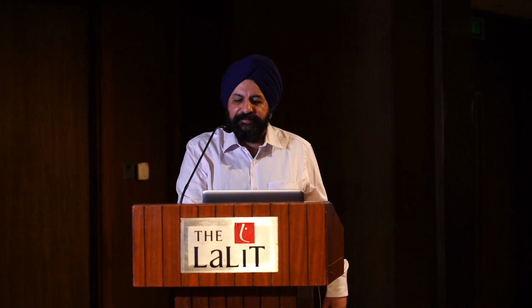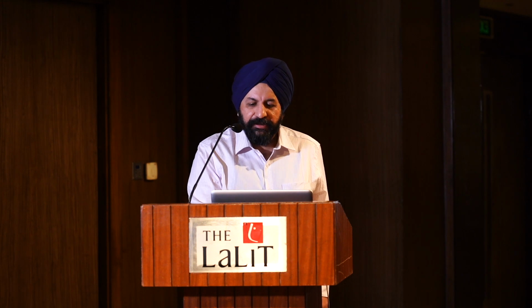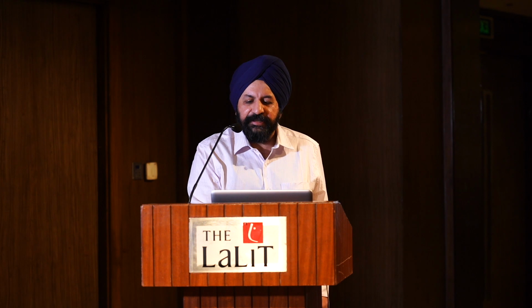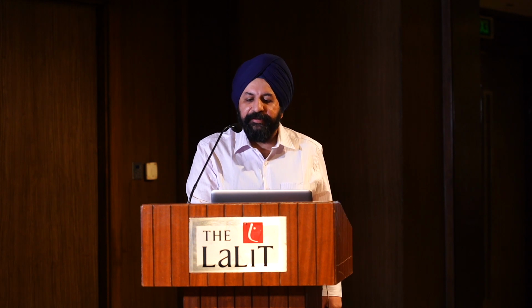Broadly, based on this, different analyzers have different technology. The one that I use is called Mindray BC6800 Plus, which uses the SF Cube technology. What it does is, there are 3 axes. On the x-axis is the side scatter or the granularity. On the y-axis is the fluorescence. And on the z-axis is the forward scatter or the cell size. So based on these scatter plots, we can differentiate a lot of cell lines. And some of them are new cell lines which have led to all these novel parameters.